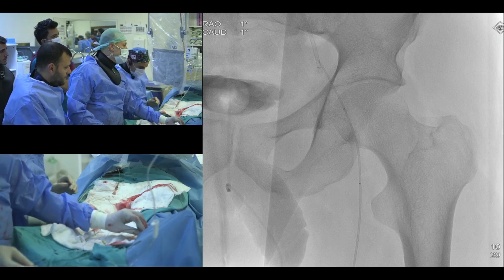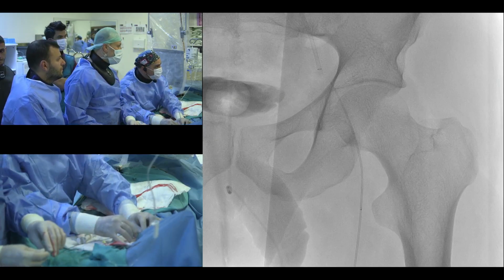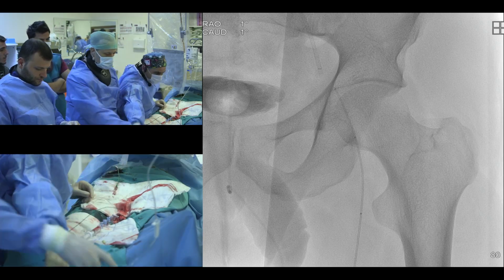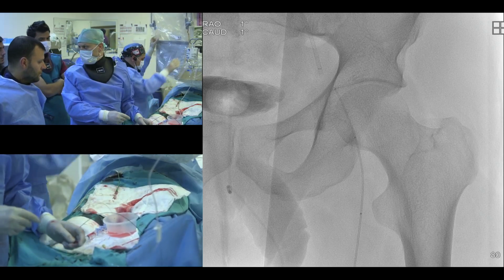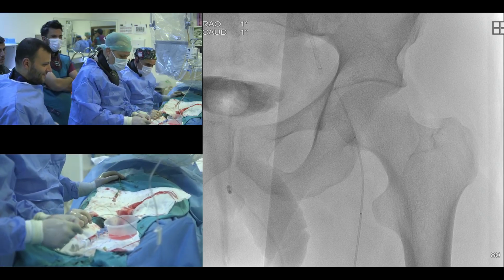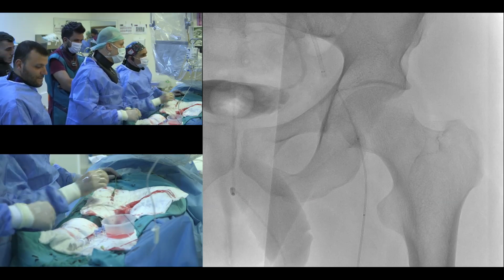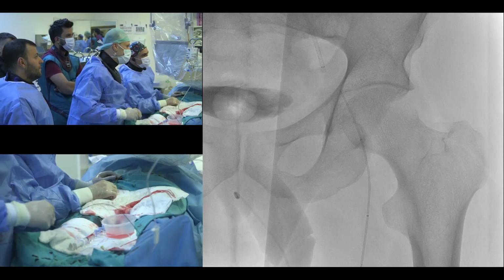Evet. Şuradan bir 0.18 tel alalım, bunun içine girelim belki. 0.18. Canlı olur, fark etmez. You need a floppy guide wire, I think. Tamam, 0.18 uzun değil mi o? I think would you like to try the tipping technique? That's right. Evet. It's a 018 wire. Gönder.